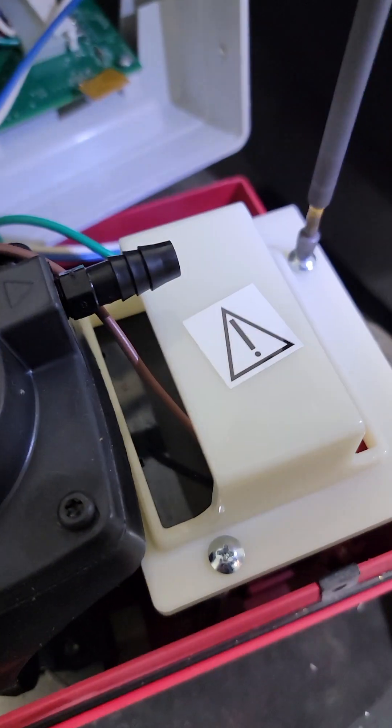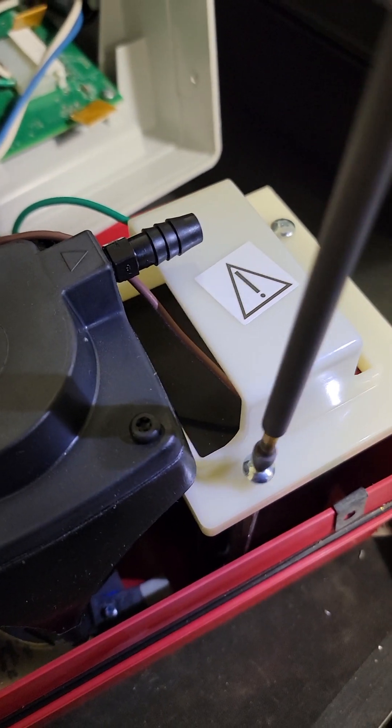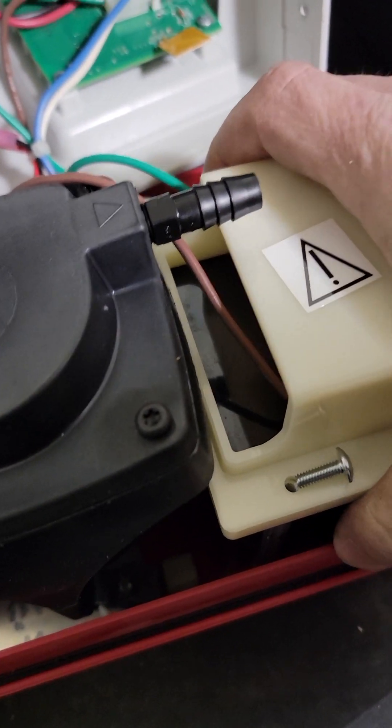Let's pull this battery. You can pull the leads off and pass the battery out to verify it, but I know the battery's dead and I gotta exchange it, so it just makes sense.